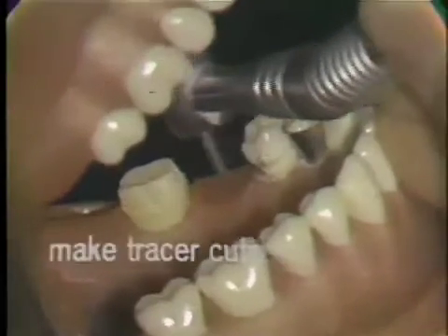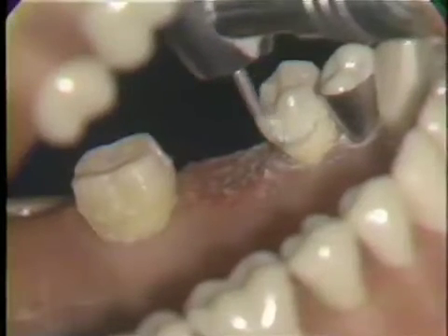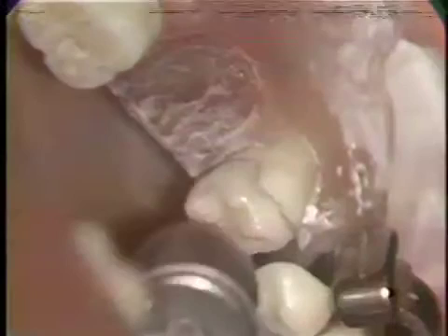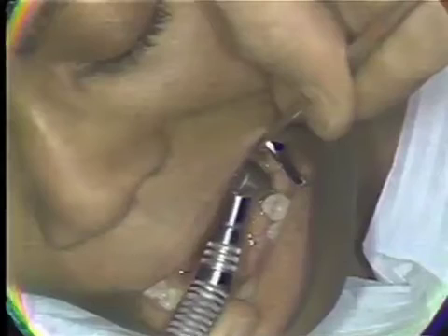Next, tracer cuts are made with a bullet-shaped diamond. The first one is placed on the lingual and distal surface, and the diamond is buried to one half its diameter. The next tracer cut is made on the distal of the bicuspid, cut from the eleven o'clock position where the patient turns slightly.